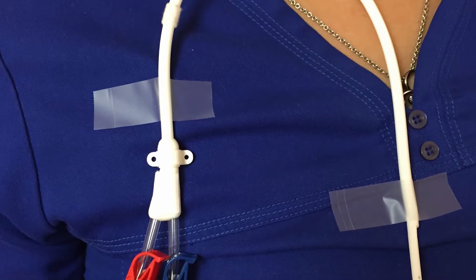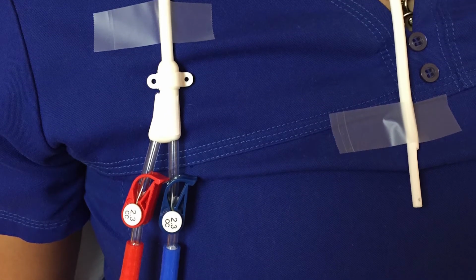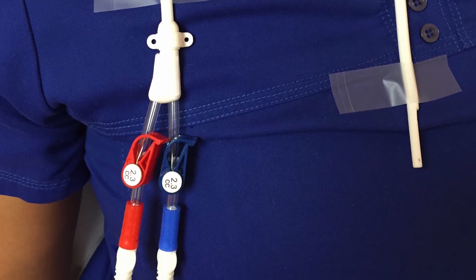The other side of the catheter comes out in the upper chest, with 2 ports showing. One port is used to take blood out into the dialysis machine. The other port takes blood back into your body from the dialysis machine after it has been cleaned. These catheters can be left in for several weeks or months. They serve as a bridge to someone actually getting a fistula or graft in their arm.